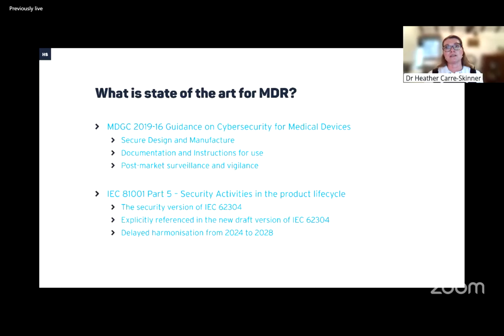And the new version, well, that's in draft at the moment on the BSI website, it actually explicitly references this 81001 standard. And annoyingly, within the EU there is delayed harmonisation of this standard. It was supposed to be last year, but it's been pushed back to 2028.